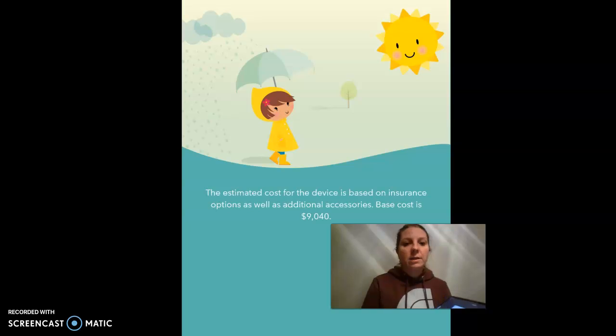So the estimated cost for the device is based on insurance options as well. The base model comes with the software options, and it does not include things such as cases, but these are, like I said, all subject to insurance. And there are also other options to purchase the device, and that is maybe through a school or a speech program, or like I mentioned, insurance, or there are also lots of grants out there. It is a little on the expensive side, but when you are giving somebody a voice, how can you put a price on that?